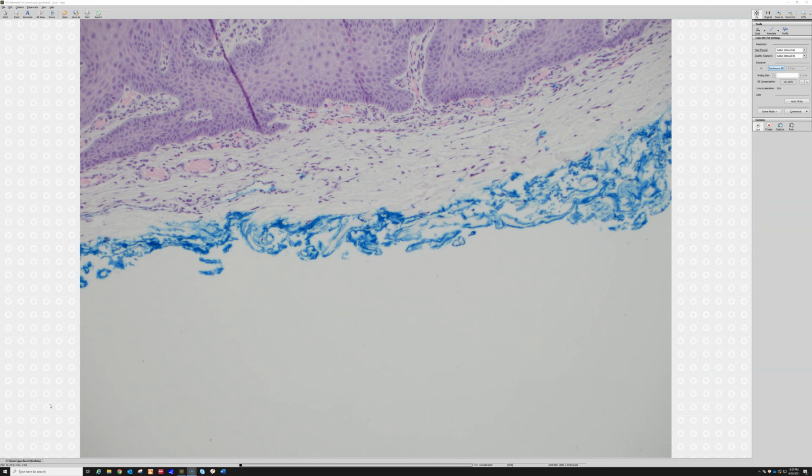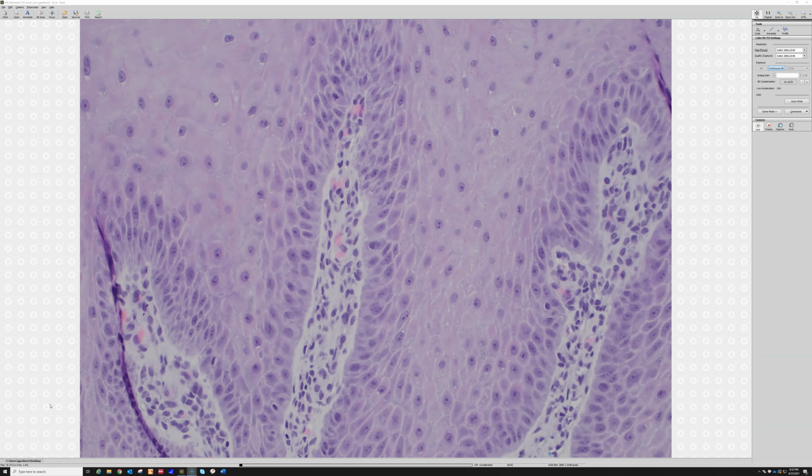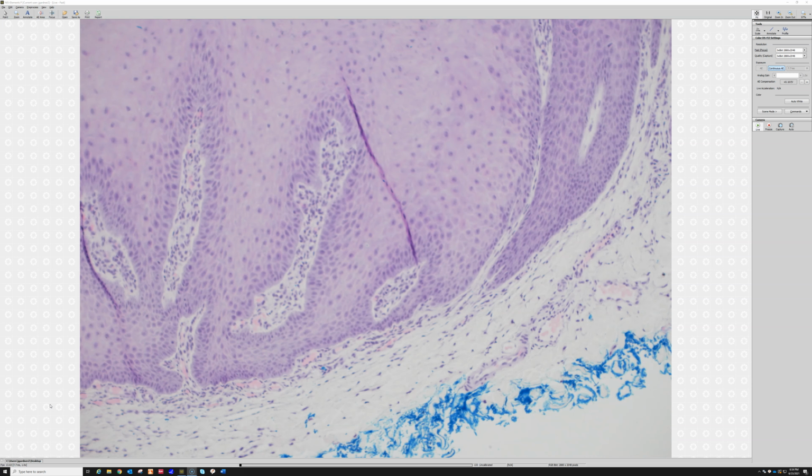So the glassiness here, and sometimes the nuclei begin to get enlarged, okay? Whether this is because of the HPV virus change, or because the wart is being irritated, or there's inflammation, or a mixture of those, I don't know. But I often see larger keratinocyte nuclei and abundant pink glassy cytoplasm in verruca. So the reason that's important is that can mimic squamous cell carcinoma, particularly if you have a partial biopsy and it's on, say, the forearm of an old sun-damaged person, the kind of person who's likely to get squamous cell carcinoma. So this can become problematic if you don't see the whole lesion.